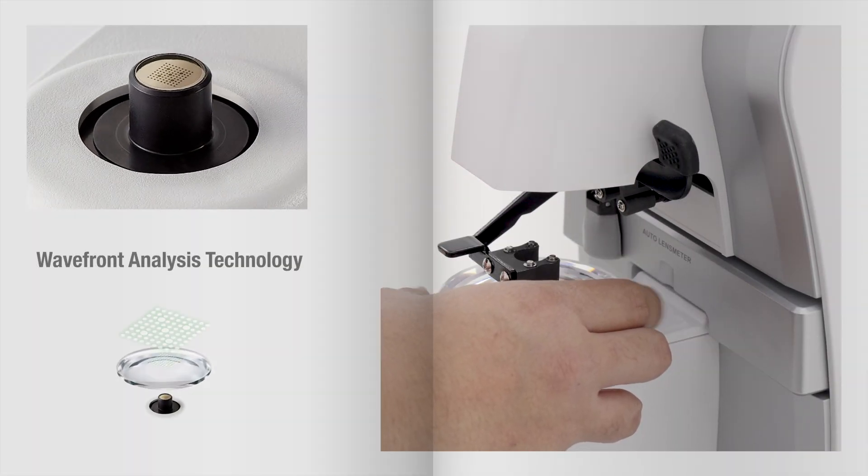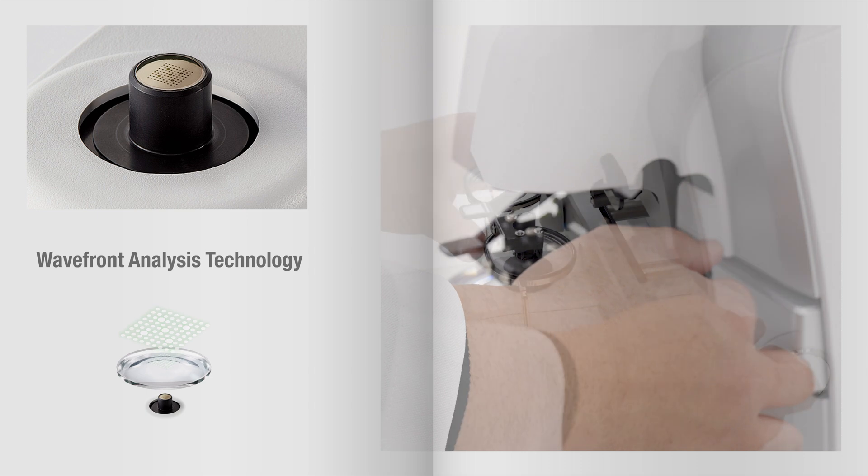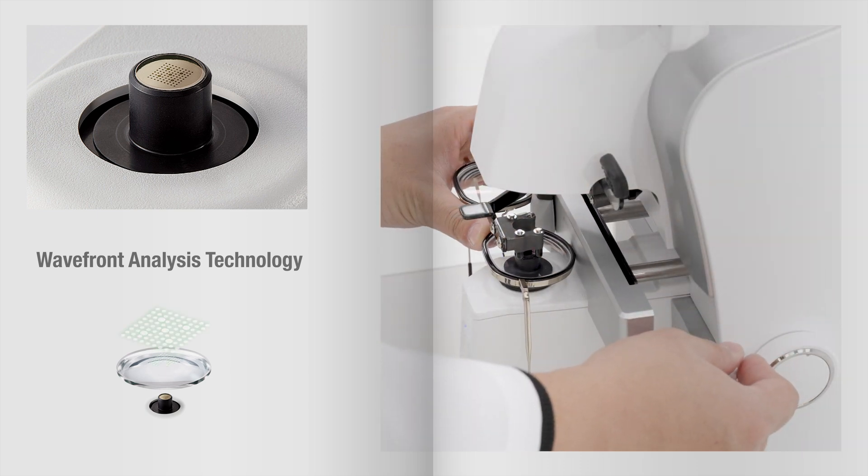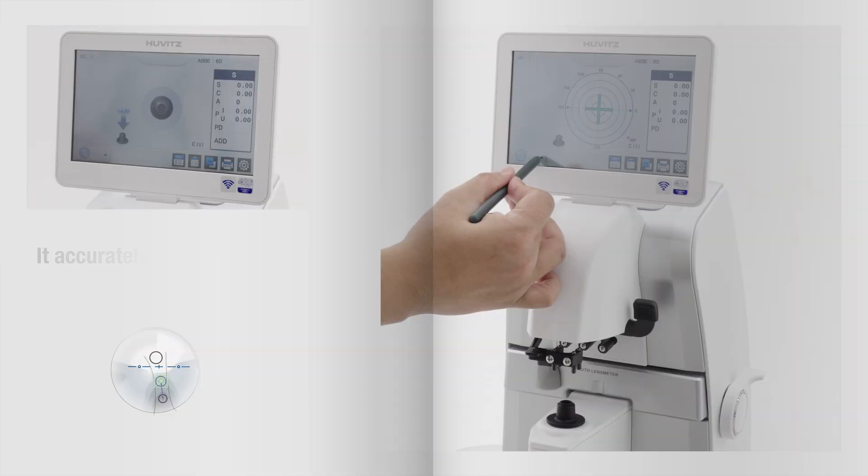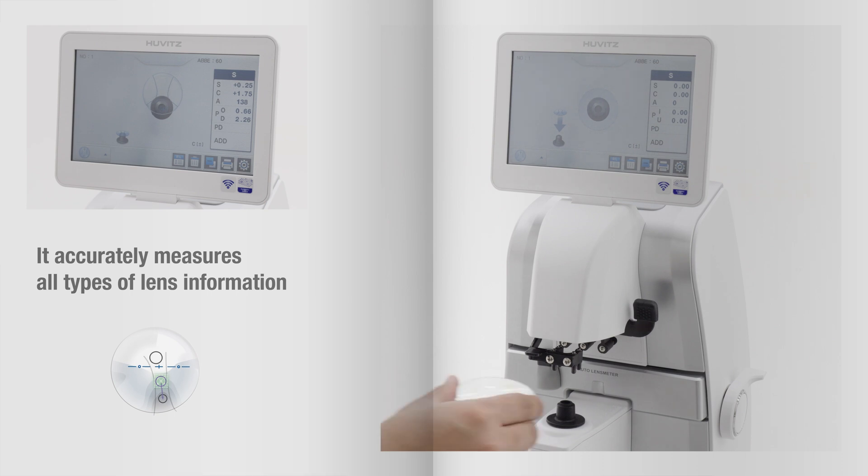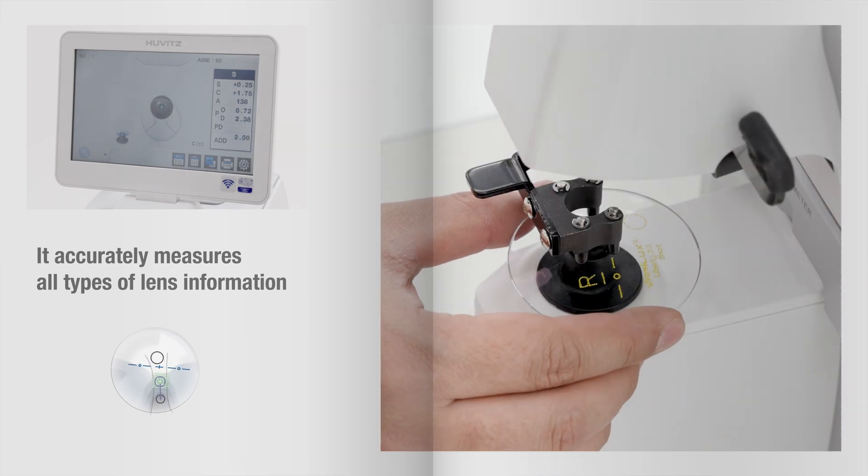Additionally, utilizing the wavefront analysis technology of the Hartmann sensor and a green light beam, the HLM 9000 accurately measures all types of lens information, including progressive multifocal lenses.